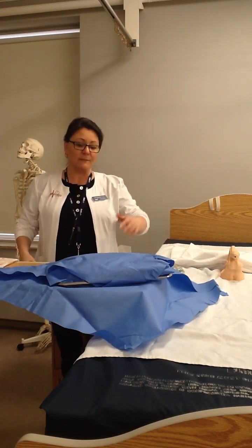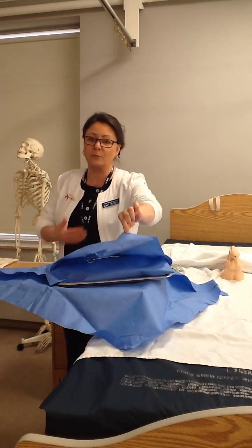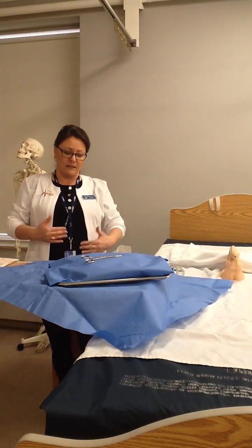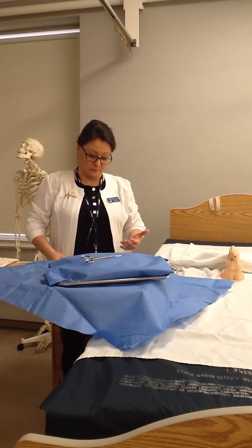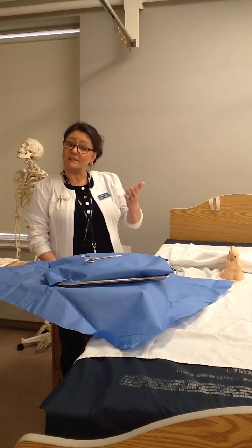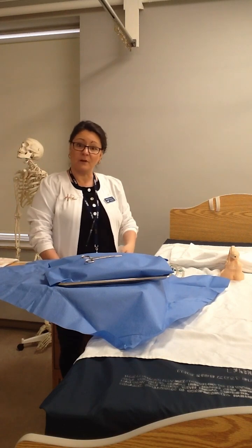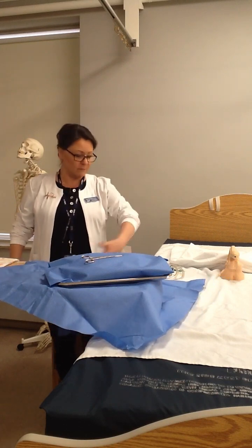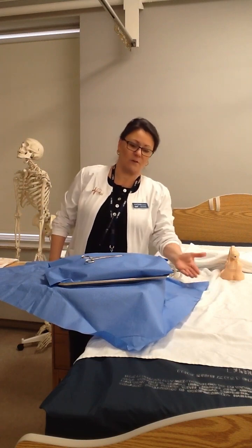And then lastly, I'm going to grab my last drape. You can see that little point sticking up, and I'm going to grab it, pull it towards me, but I'm taking a step back. I never want to be too close to my tray and end up contaminating something with my uniform. So remember what we talked about in our principles. The drapes that fall down below the table are no longer sterile, so you can move those out of your way. If it's covering your garbage bag, move it out of the way. Move those out of the way. It's not sterile there anymore.